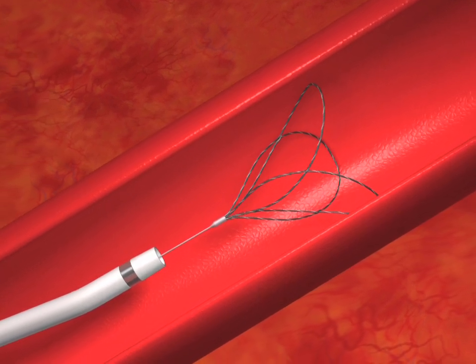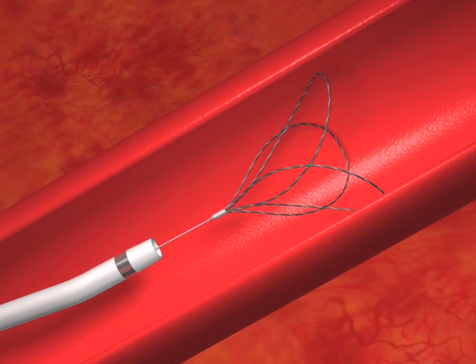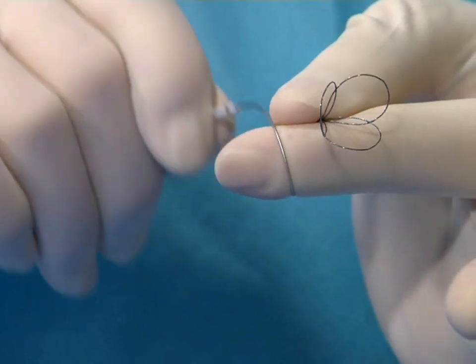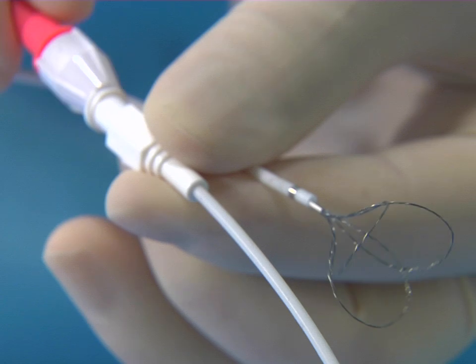The snare loops are constructed of super elastic nitinol wire providing flexibility, kink resistance, and superior one-to-one torque control.